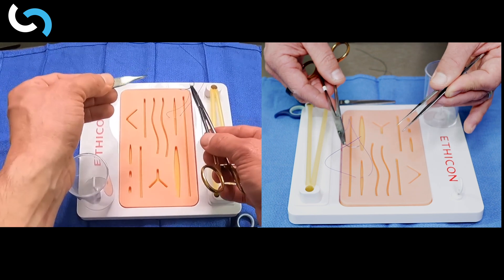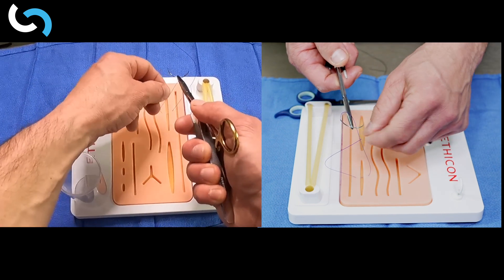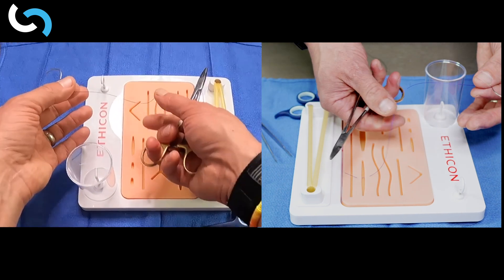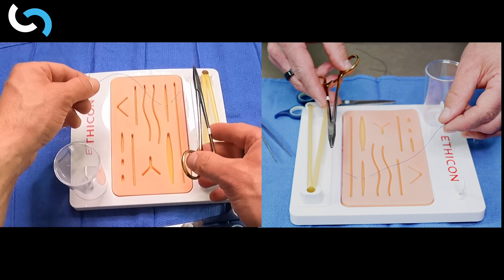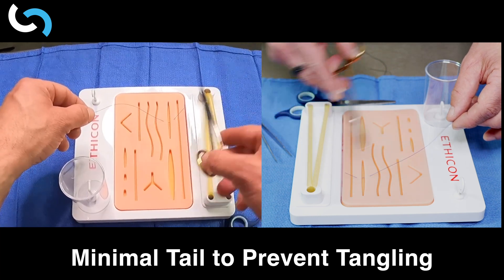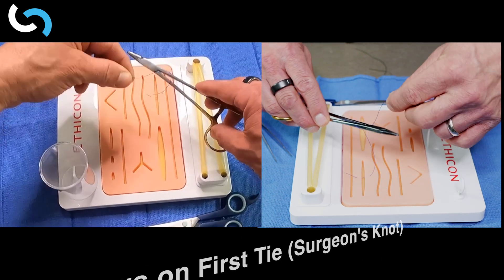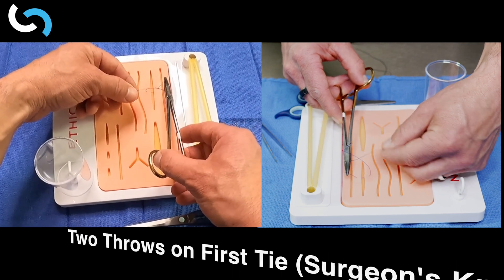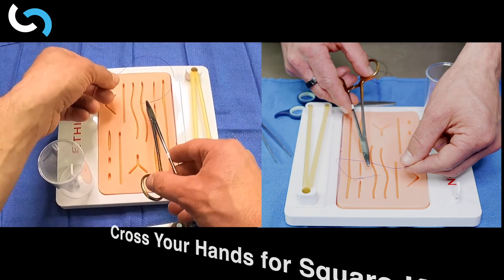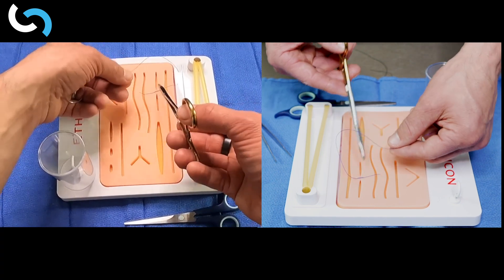In this case we're doing an interrupted suture, so I put my forceps down or transfer to my other hand, let go of the needle, pull the suture through, and now I'm ready to tie my knot. We want to tie square knots. We want to keep a minimal amount of suture tail out so we're not getting caught up in the suture. We grasp it in our left hand, do two throws — which is a surgeon's knot — grab the suture, and then cross our hands and pull it together. As long as we don't lift up, that's going to approximate the tissue and close it without strangulating it and making it ischemic.